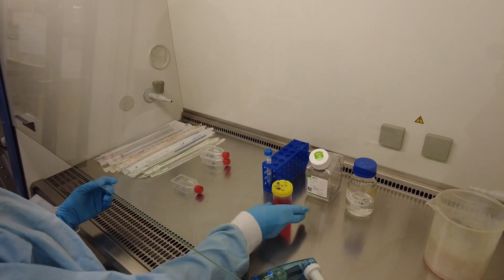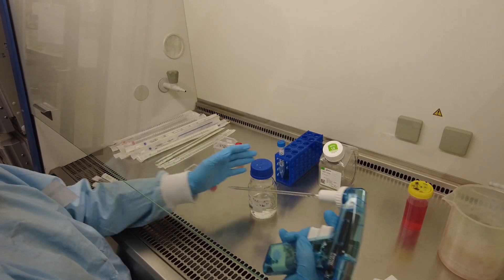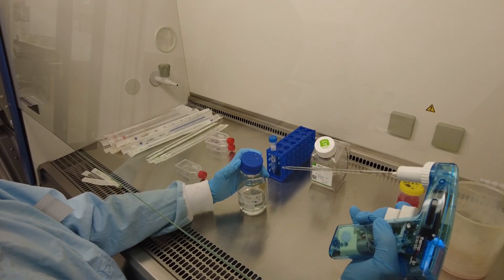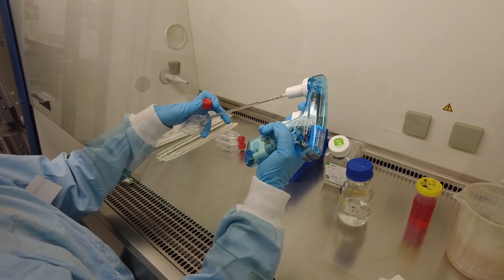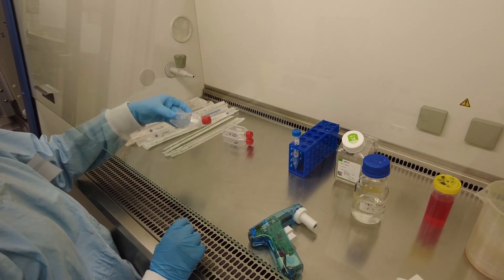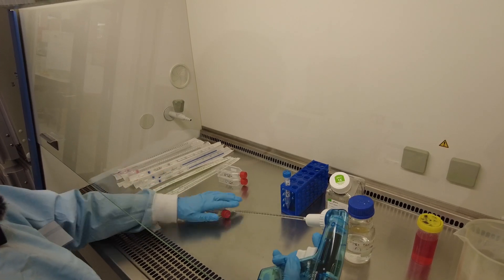Remove the old media, then we're going to wash with PBS, just two mil. We'll wash the cells, then remove.